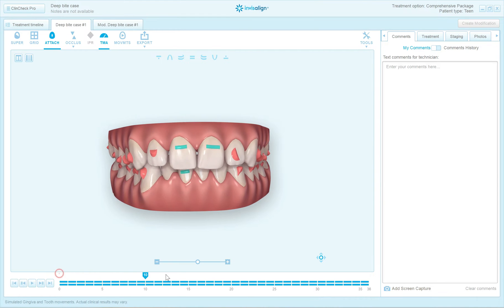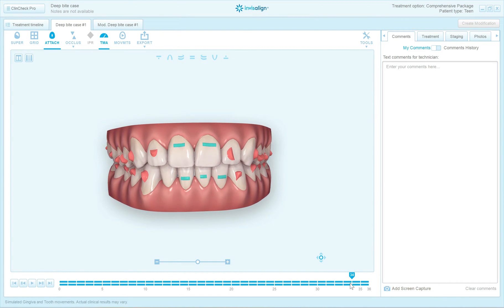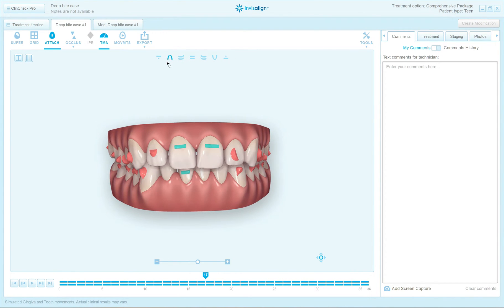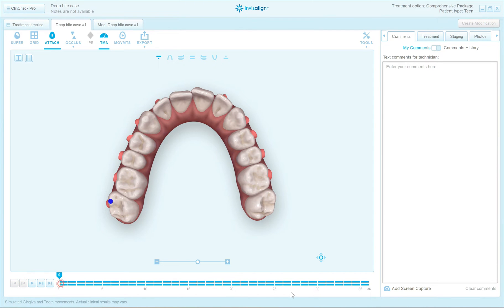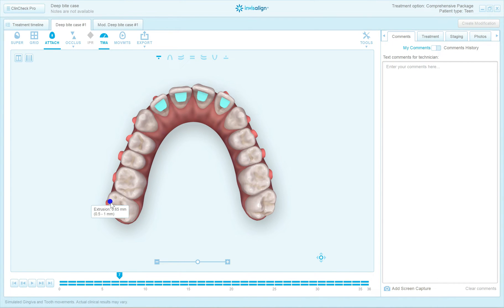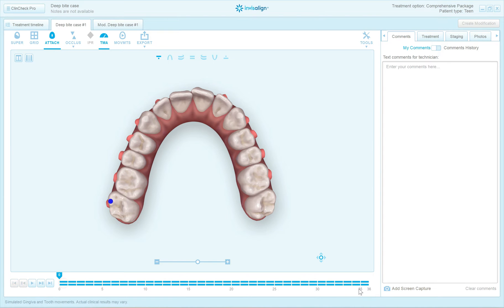This is a DeepBite case. There are some posterior movements that I think are unnecessary. Look at the blue dot right here — that blue dot is the TMA, the Tooth Movement Assessment Notification, indicating there's a complex movement with a second molar. What I always do when setting up a DeepBite case is set the arches first. I want to simplify movements in the arches.